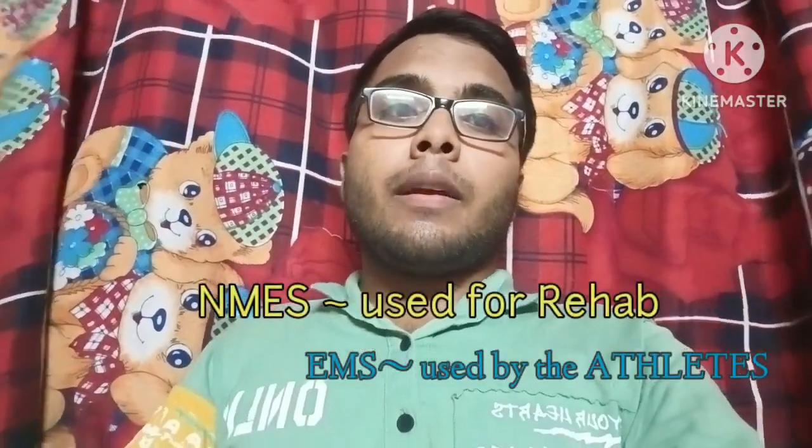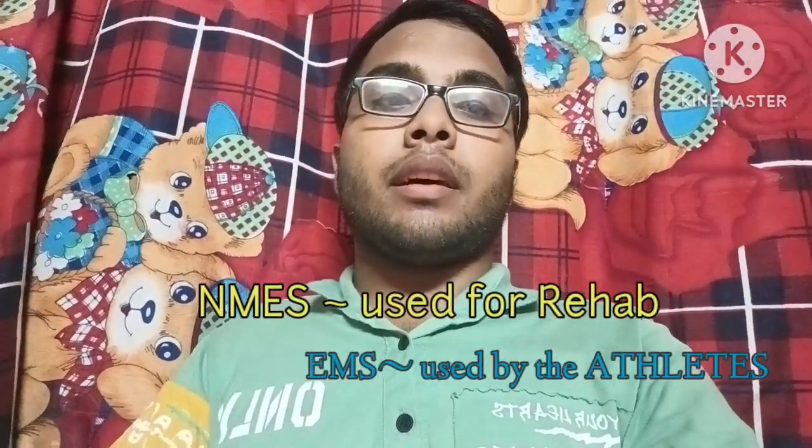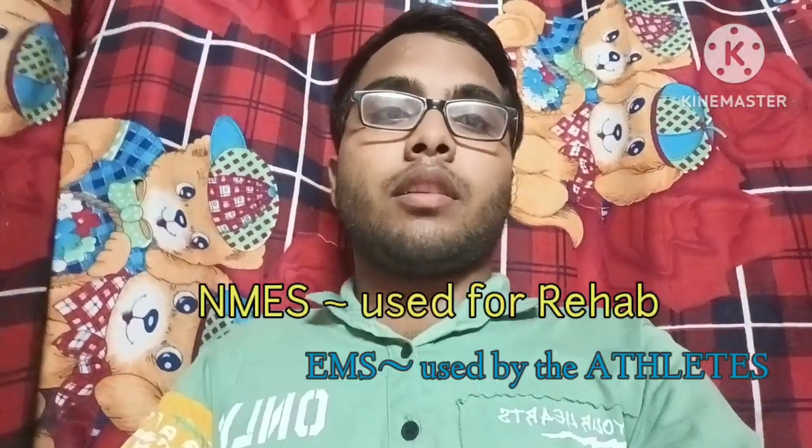Another application of low frequency current like Faradic current is EMS, meaning electrical muscle stimulation. It is used to strengthen the muscle, to improve muscle endurance, and to accelerate muscle recovery. So EMS is mainly designed to make the muscles contract strongly, and it is used by athletes for muscle recovery. That is the main difference from NMES. NMES is used in rehabilitation, and EMS is used in muscle recovery for athletes.